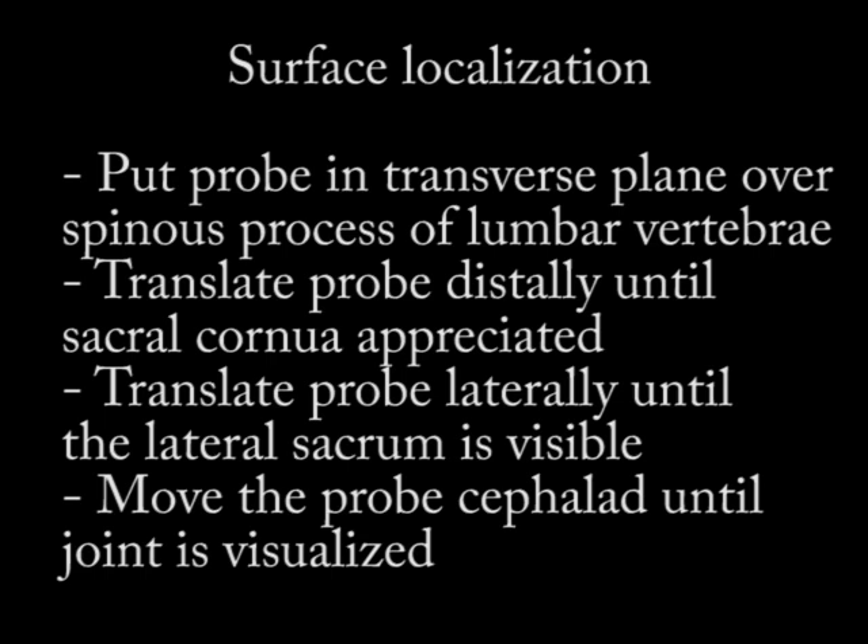With surface localization, I put my probe in the transverse plane over the spinous process of the lumbar vertebrae to start. Then I translate that probe distally until the sacral cornua are appreciated — these are easy to identify. Once identified, I translate my probe laterally until I appreciate the lateral sacrum, then move the probe cephalad until the joint is visualized. Sometimes I also have to rotate the probe so the lateral aspect is going more cranially.